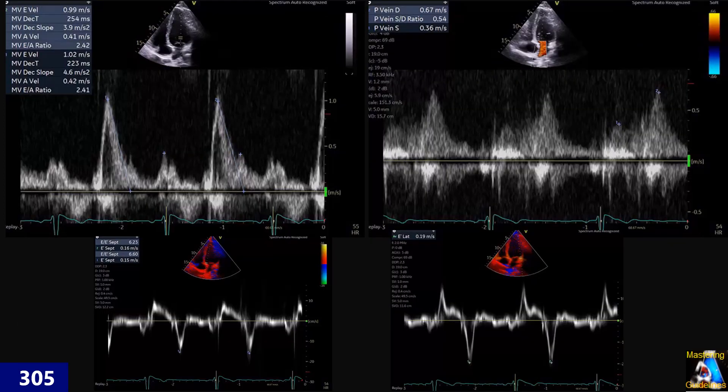Here are the diastolic parameters. I forgot to mention: the measured EF was normal, LA and RA volume normal, index normal. There wasn't any abnormal Doppler on the mitral valve, on the aorta, or tricuspid. Tricuspid regurgitation was upper limit normal with the IVC. Right ventricular systolic pressure was around 30 to 35 mmHg.